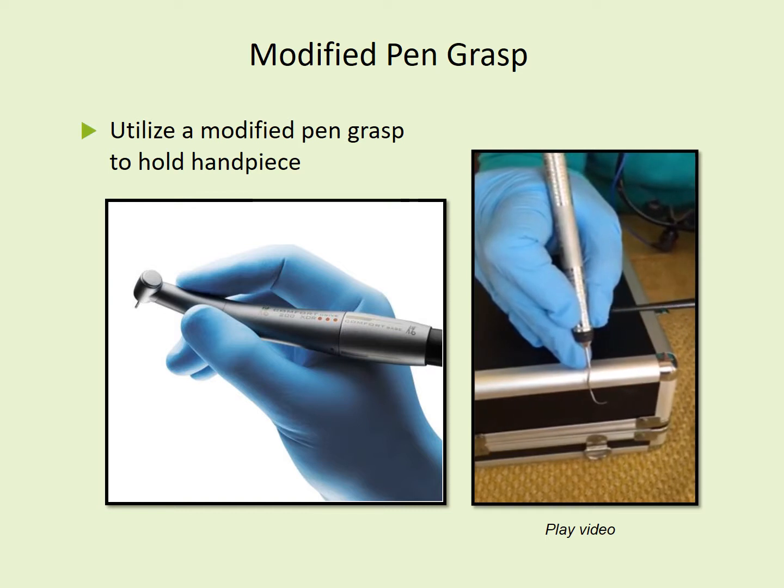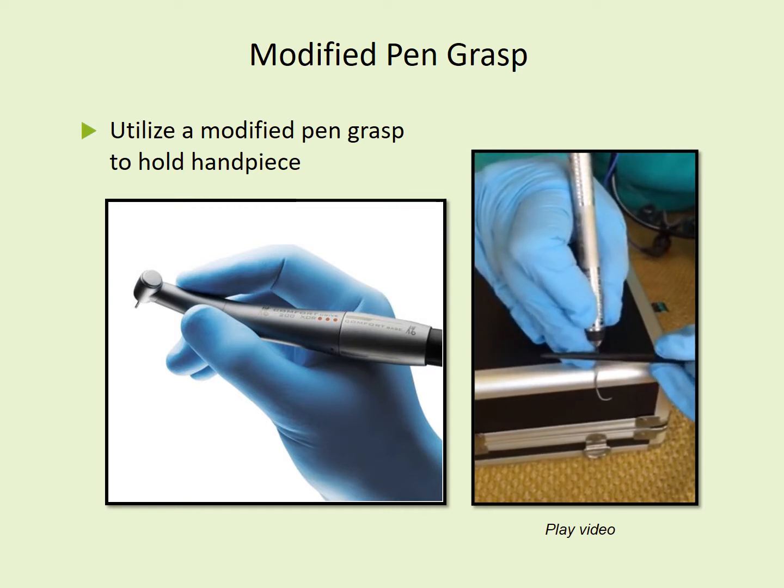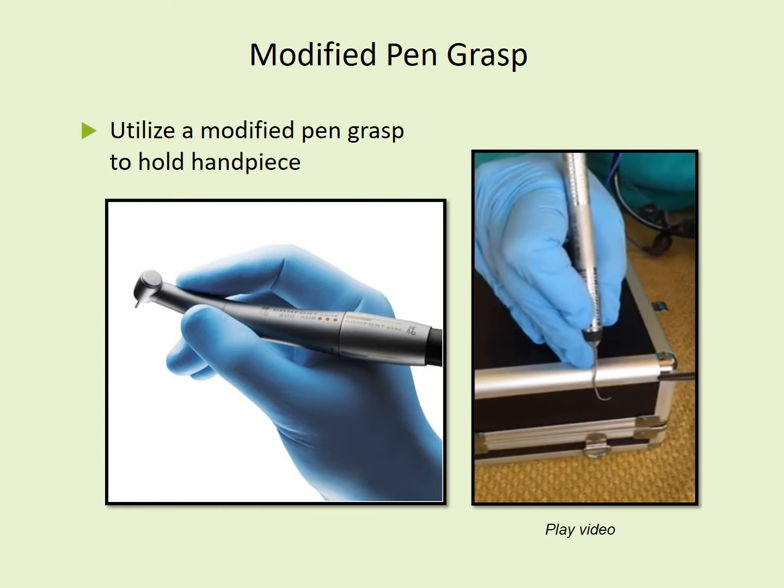So the thumb is in this position. The index finger is pretty well bent, but not flexed a lot. The tall finger is slightly bent, a little less than the index, and the side of the instrument touches against this finger. And then your fulcrum finger is relatively straight, and that's your support. The baby finger doesn't matter at all.